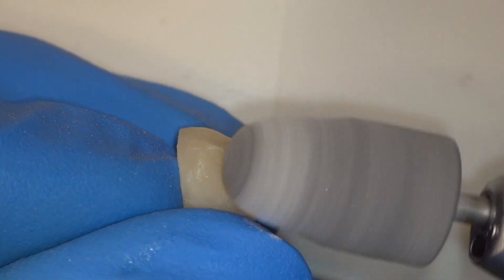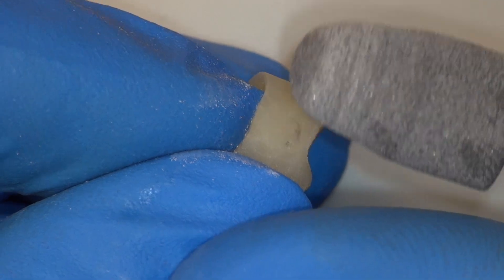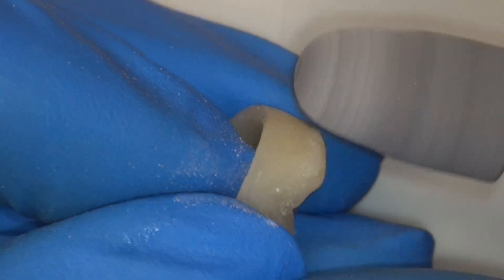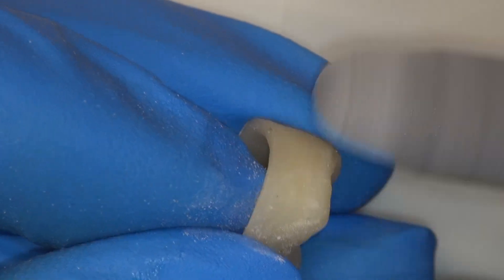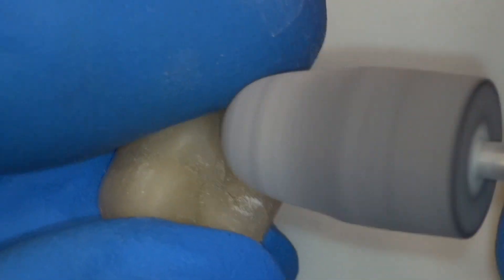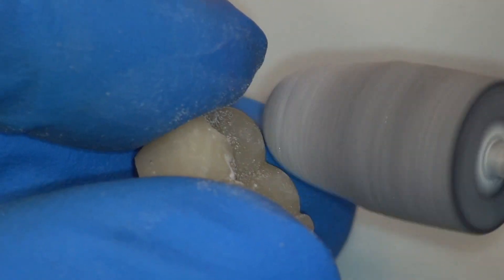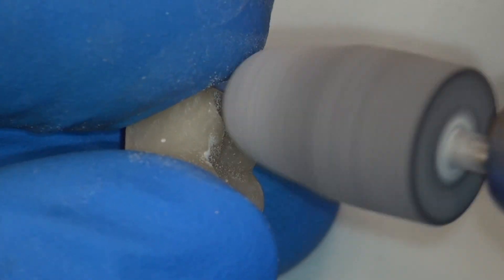A light finishing of the entire temporary surface is done using a medium grit polisher at a speed of 5 to 15,000 rpm. Lightly finish the occlusal surface as well, but do not grind aggressively because you will flatten out the occlusal anatomy.